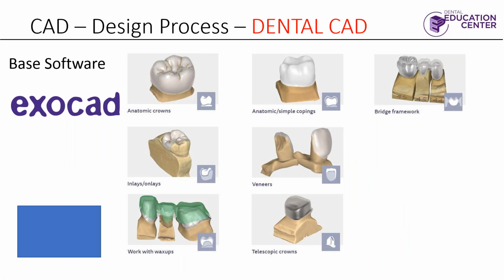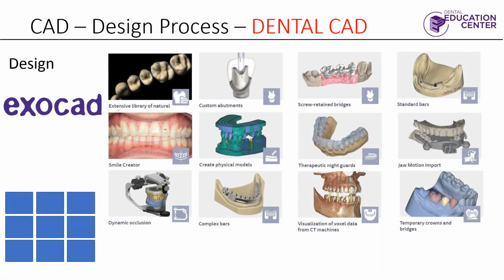You basically would start out with the base software in dental CAD. Obviously, anatomical crowns, single copings, frameworks, veneers, inlays, onlays. I think this was very similar to the dental CAD. But what makes it powerful are the add-on modules. And these modules are extremely extensive. I think there was like 12 last time I counted.